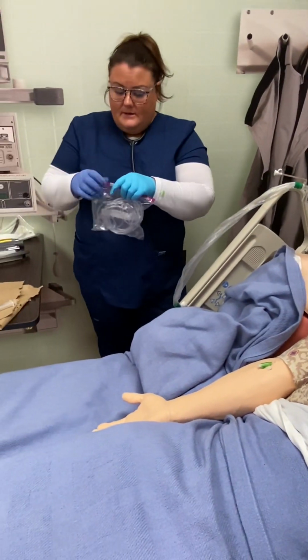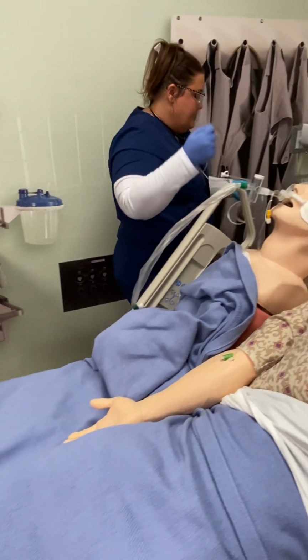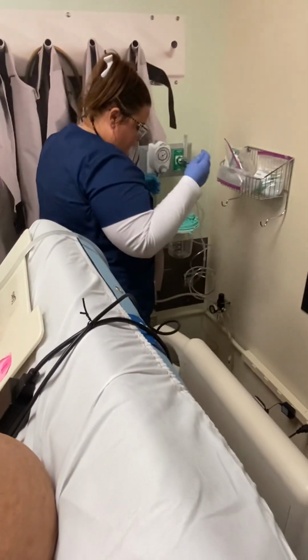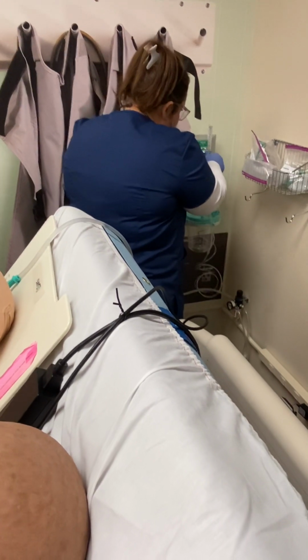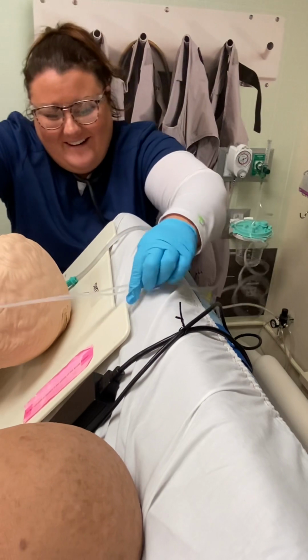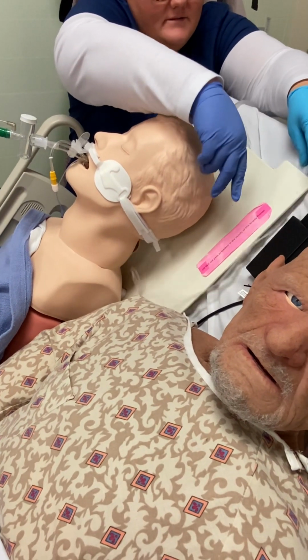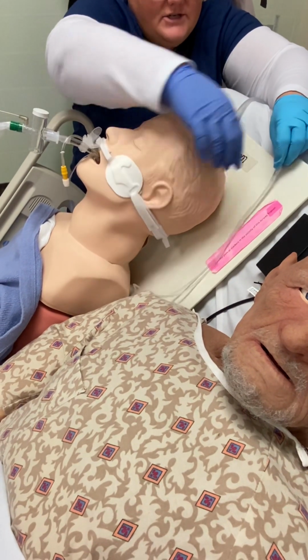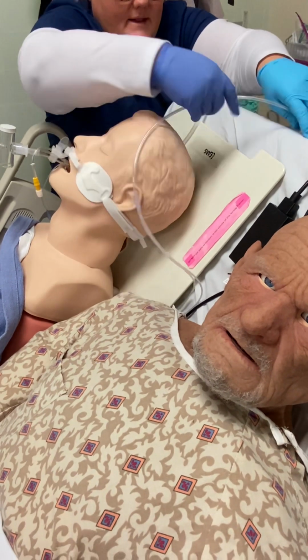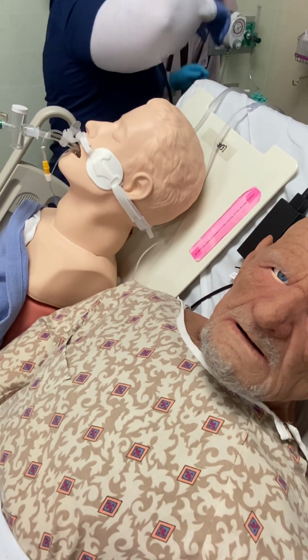So I'll get my nasal cannula ready. Lord, I'm like a bull in a china shop. Okay. All right. I'm gonna have my cannula over here. Sit it there. And I would make sure that it's in the packaging, obviously in a safe place. There. Doesn't want to stay. Okay. There we go.